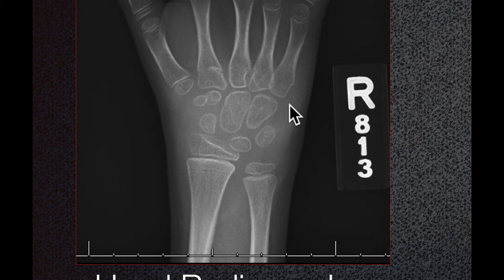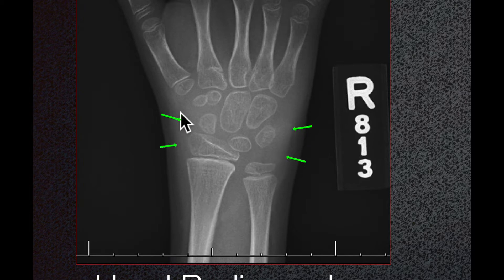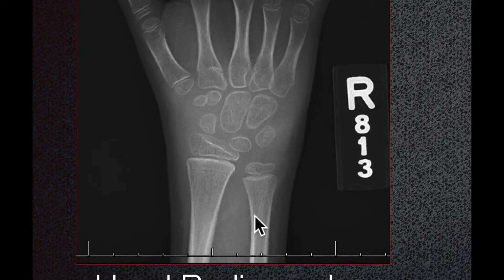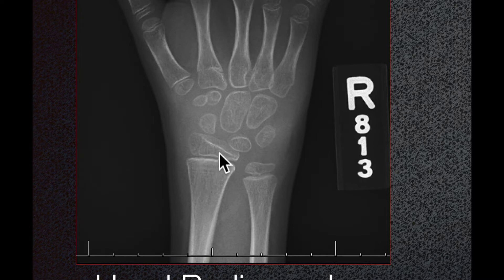There is increased density of the soft tissue, as you can see here, consistent with soft tissue swelling. There is no subluxation of the joints. Subluxation would be characterized by a change in alignment of the carpal bones or radiocarpal alignment.